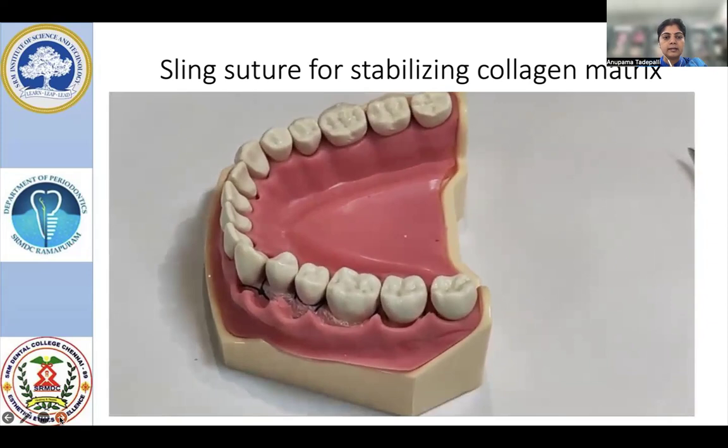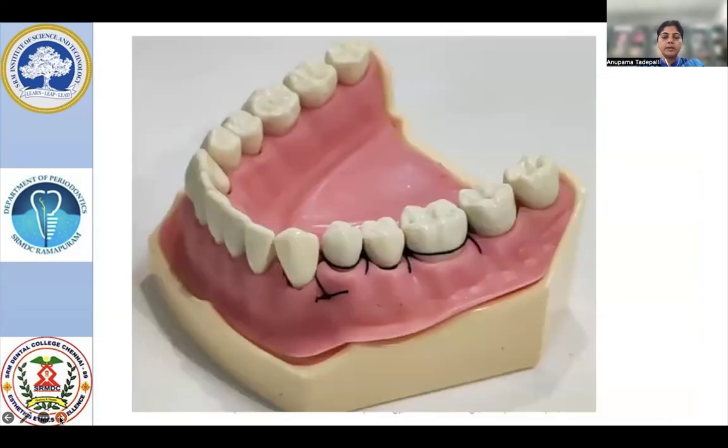For either connective tissue graft or collagen biomaterial, once you finish suturing, the superficial flap has to be approximated onto that. For this, you can use independent sutures or you can use once again a sling suture. As shown, continuous sling involves all the facial bites — encircle, then come lingually and interdentally back to the original first interproximal area and place a knot. Whenever you do continuous sling suture, it is preferable and advisable to place a periodontal dressing.